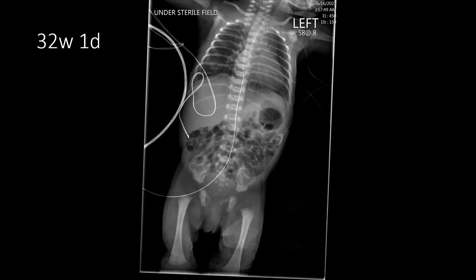Here we have a 32-week, one-day-old premature infant. We can see this catheter overlying the abdomen, running from somewhere near the umbilicus directly up to that inferior cavoatrial junction. Roughly, your inferior cavoatrial junction can be judged by the location of your diaphragm. This is maybe slightly above that cavoatrial junction, but it's actually in a pretty reasonable position to be used.